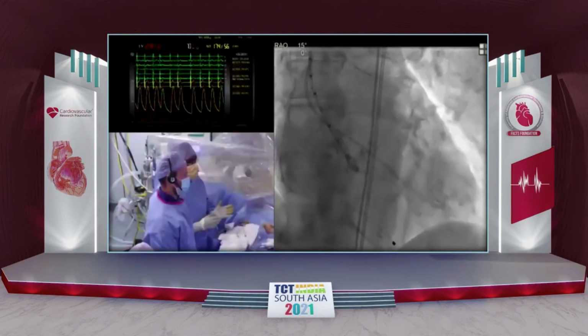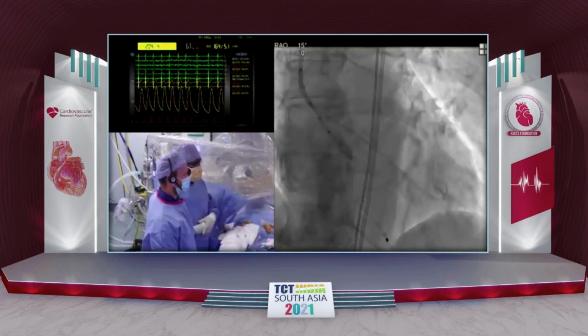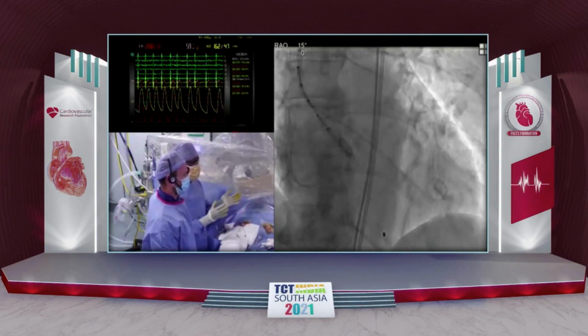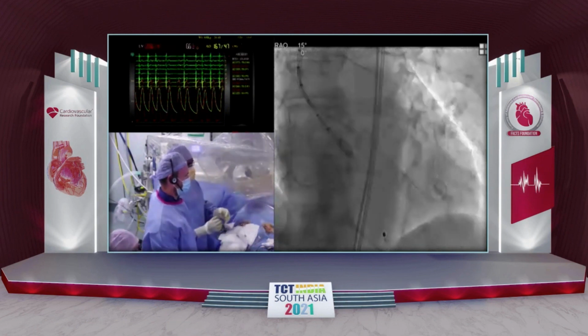So the original concept was that Navitor, or the Portico, was not to be put in truly elliptical anatomies. What I found, and now we have some data, is that Francesco Bedogni's team in Milan were able to show, both at the bench and in a modeling technique comparing the Portico frame and the Medtronic Evolut R frame, that the Portico actually behaves better for forming seal in elliptical anatomies. I think the reason is that in a square inch, there's less metal in the Portico system than there is in the Evolut system, and therefore it will oppose better and align better to ellipticity.